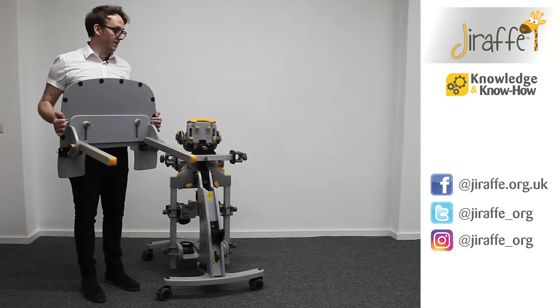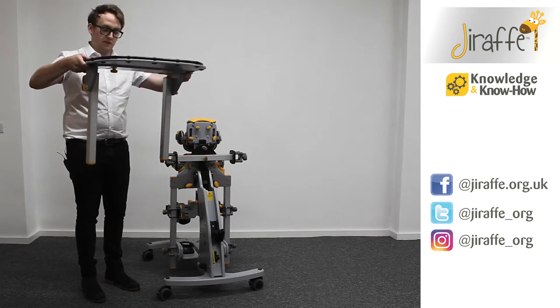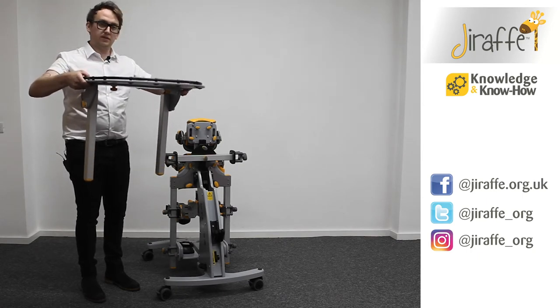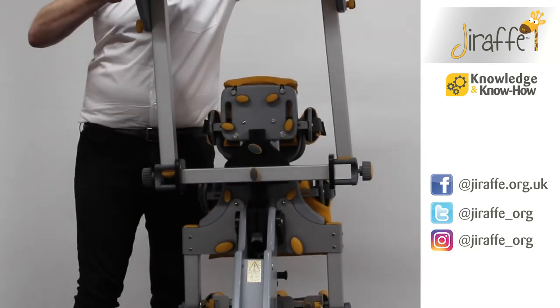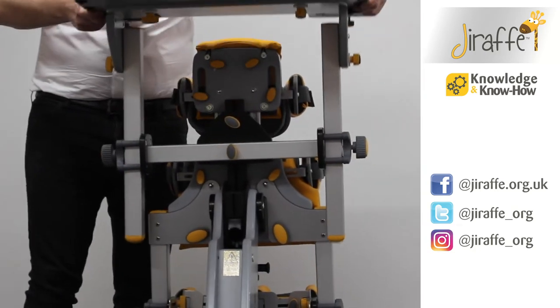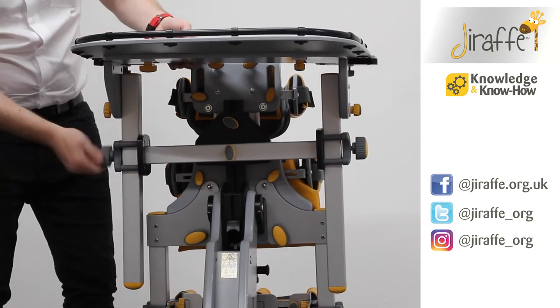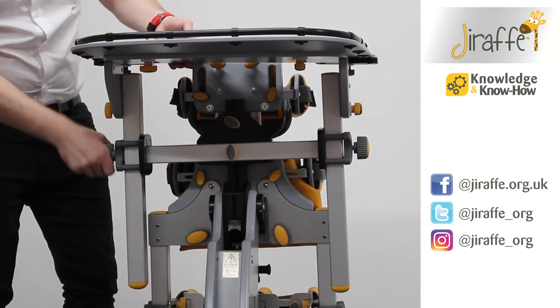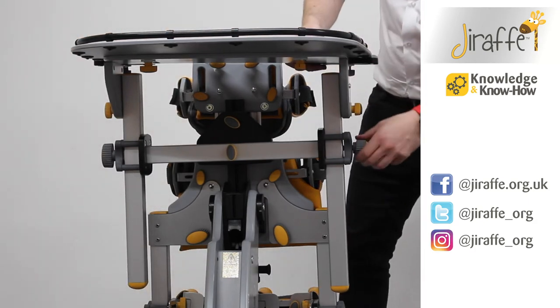Fitting the standard tray into the tray bracket is very straightforward. To fit the tray in a prone position, make sure that the arms of the tray are pointing in a downward direction. They will simply slot into the tray bracket like so, and when you've got the tray to the desired height you can just tighten the wing knobs either side of the tray.